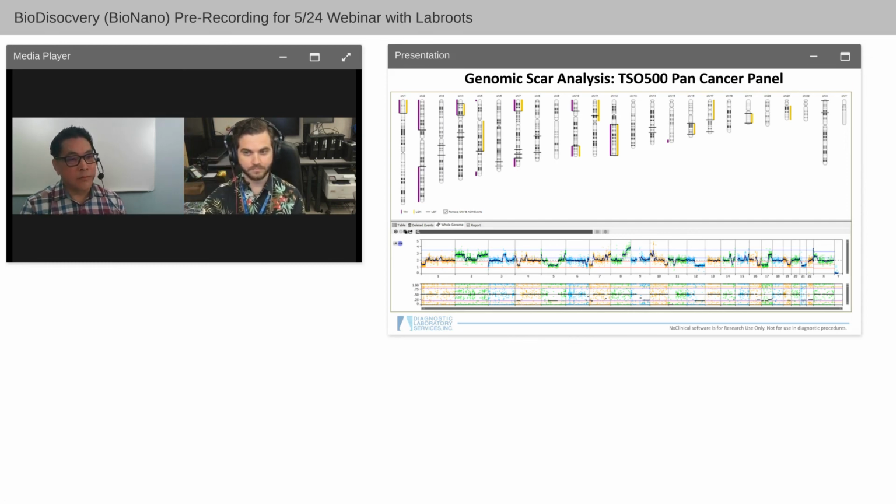So to overcome things like tumor percentage, we'll be looking at where is the drop off for tumor percentage based on microarray, and we expect it to be somewhere around 20%. So in this workflow, if we were not able to assess HRD by NGS, we would flip into microarray assessment of HRD, and then still using the same bioinformatic pipeline is going to be very helpful to be able to report that data.